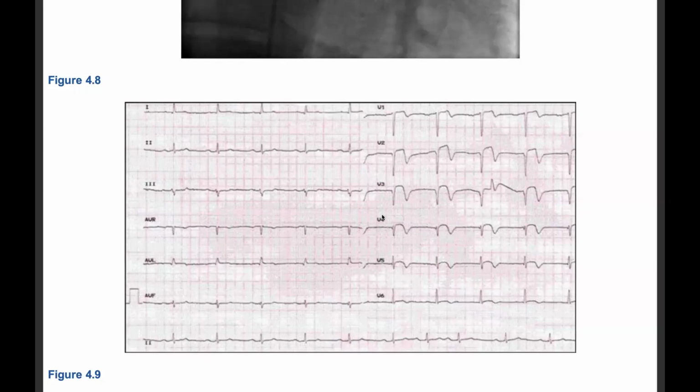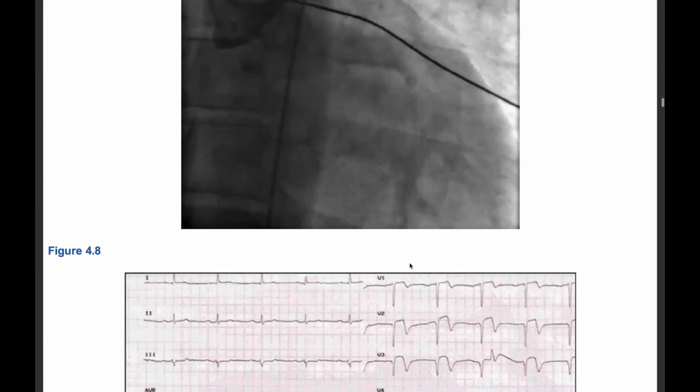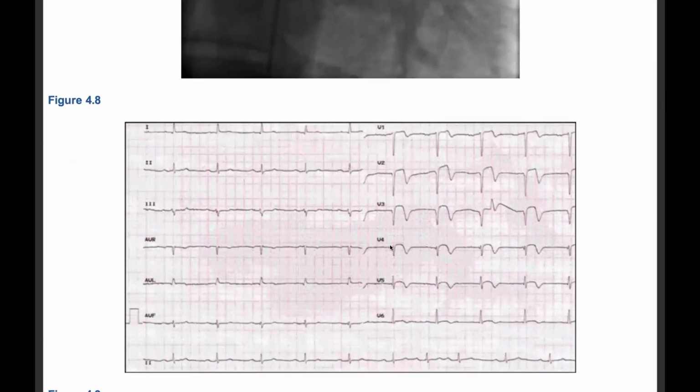But what won't speak for hypertrophic cardiomyopathy is that the R waves, the QRS, are not really that tall. With left ventricular hypertrophy you tend to get very tall QRS complexes as well. But how do you know on the ECG that something is subacute? Is it because of Q waves?